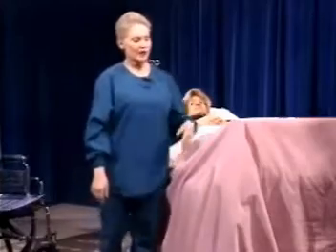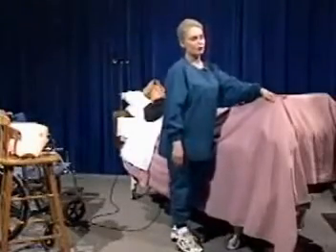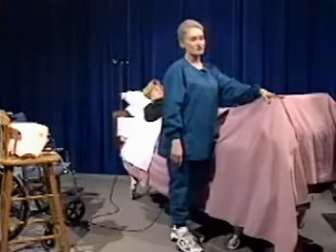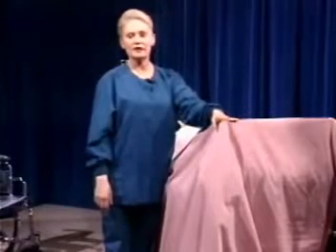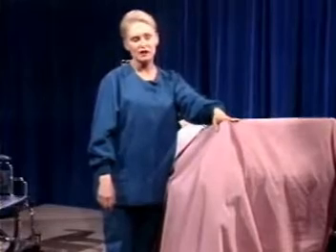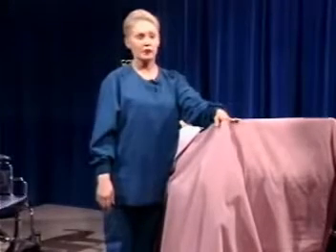As you can see, the blankets are suspended with the cradle, and the purpose of the cradle is to help remove the weight of the sheets and blanketing from the feet and ankles of the patient. In a patient that has severely impaired mobility, that is, they have difficulty rolling from side to side or repositioning themselves, even the weight of a tightly tucked under blanket can create problems for heel breakdown and sores because they feel they actually cannot move.